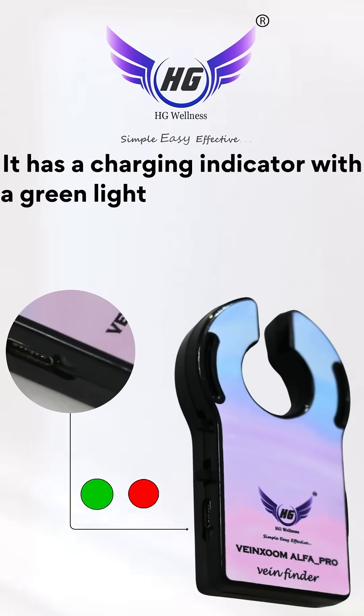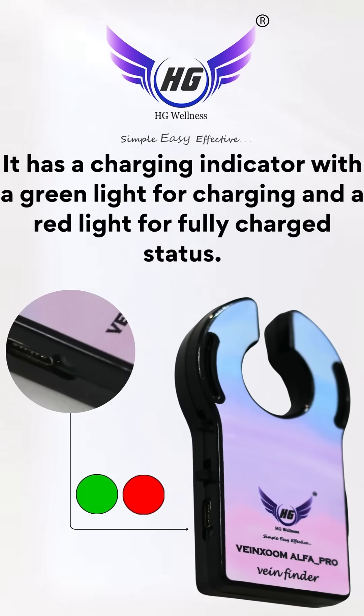It has a charging indicator with a green light for charging and a red light for fully charged status.